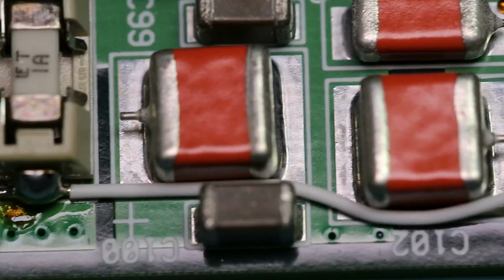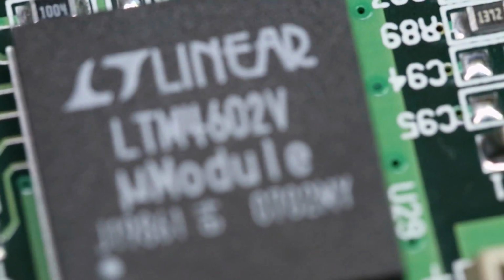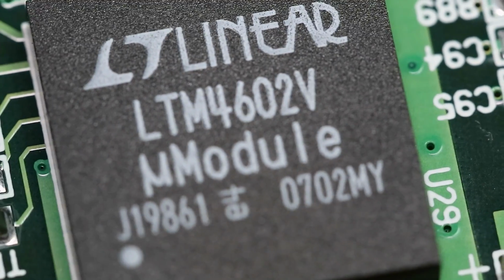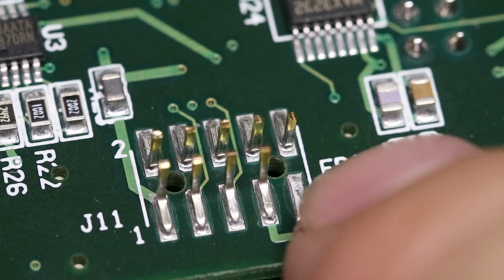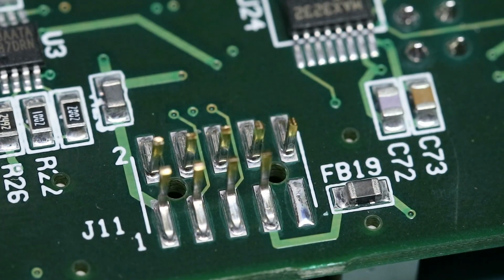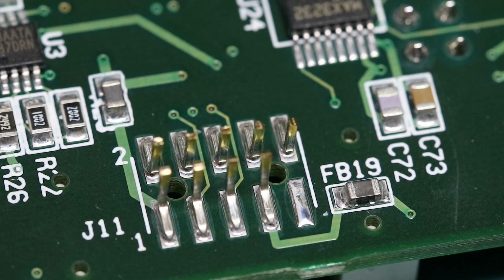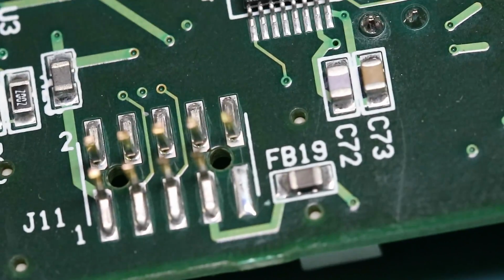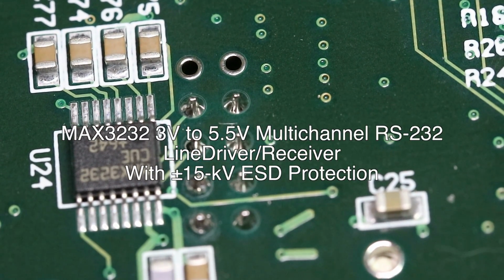I noticed on the back there's also another bodge job with a little wire going between these 2 fuses. I like this capacitor design with the little pin to show you which way positive is. These are not too little, but they're linear micro module DC to DC converters. This is the connector for the USB flash drive, and it's really just some bare surface mount pins. It doesn't seem too stable, although it's probably not something that ever gets changed. They probably just install this module at the factory and it never goes anywhere. And like I said, it had a nylon washer and screw on it, so it can't really move anywhere. And a Max 3232.